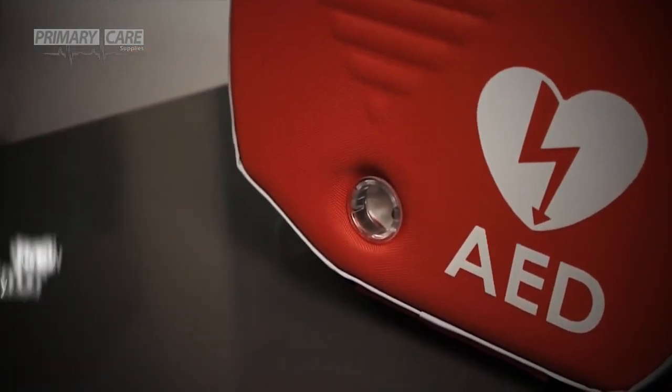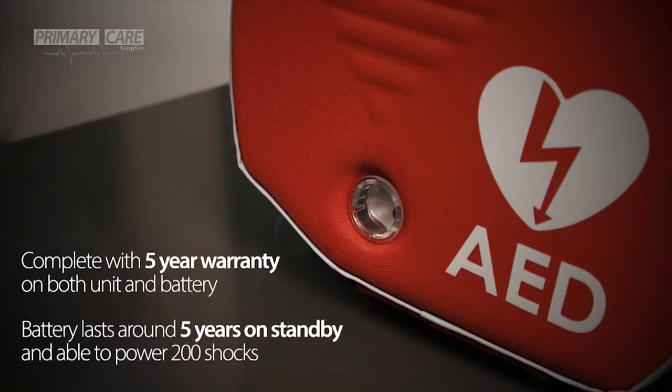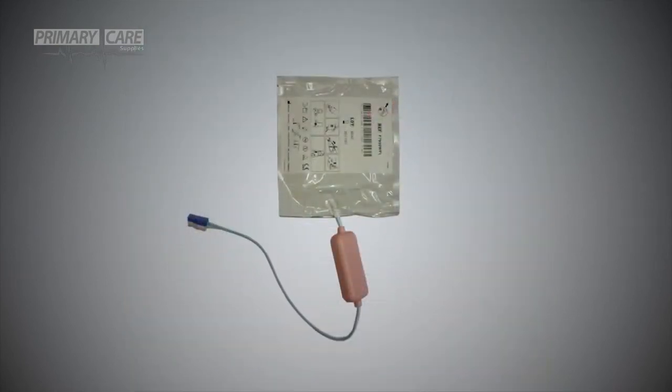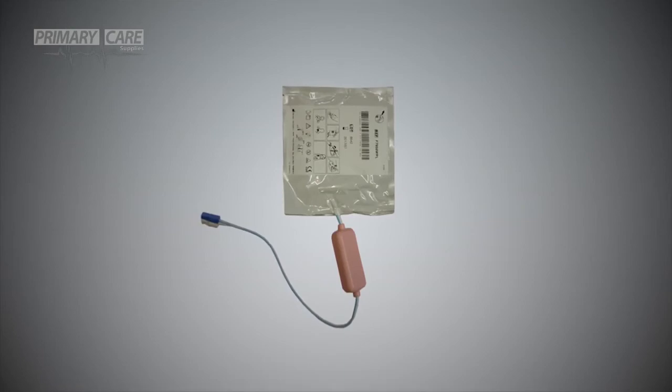The Rescue Sam, including the battery, comes with a 5-year manufacturer warranty. The battery will last around 5 years when idle and is able to power up to 200 shocks. Accessories such as the wall bracket, indoor and outdoor defibrillator cabinet, and paediatric pads for use on children under the weight of 25kg are available separately.